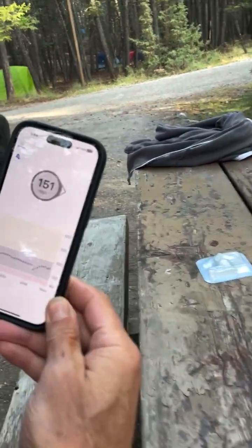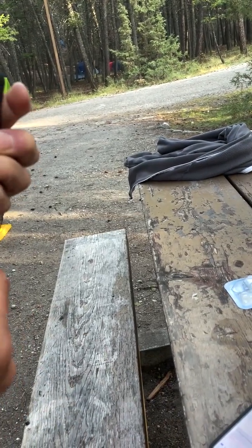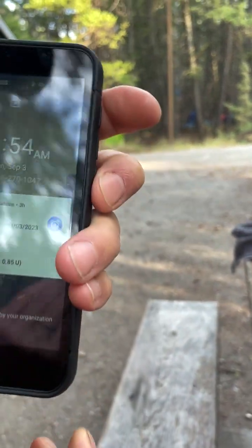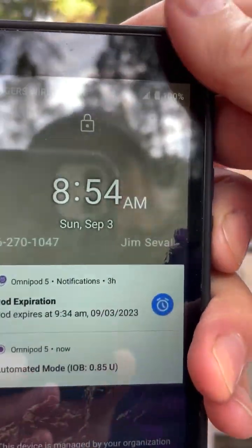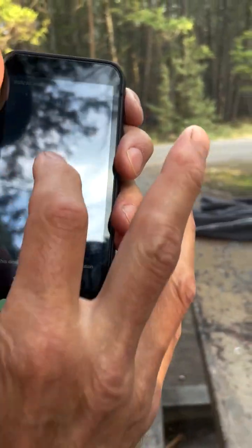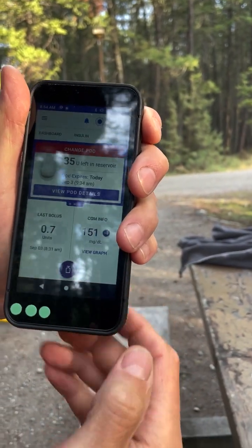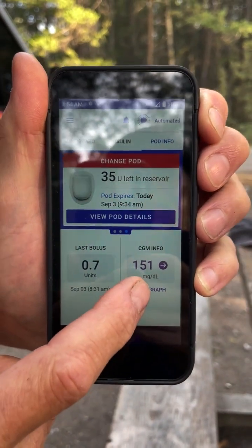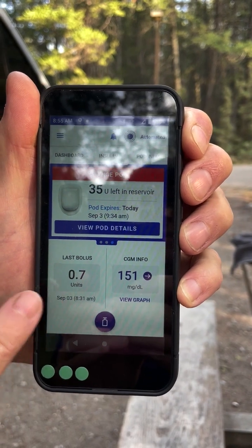The way this works is the Dexcom is hooked up to my phone, but this is my PDM for my Omnipod. Let me just push in my code and it will show me — it reads my CGM value off my phone. So I'm at 151. I have 0.7 units on board.